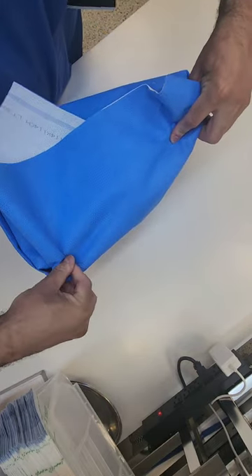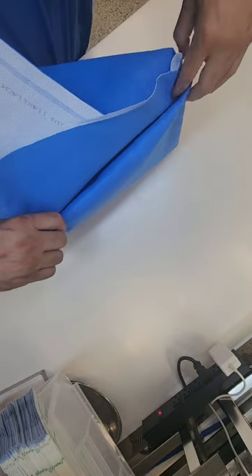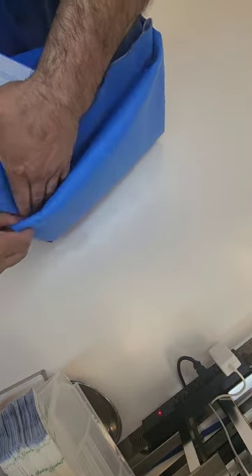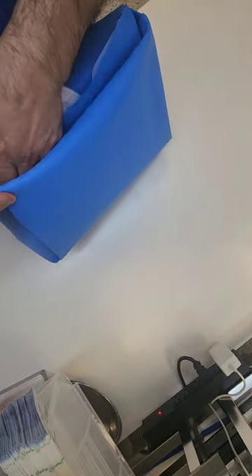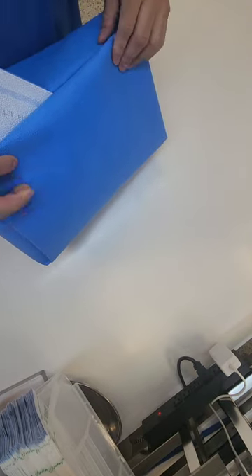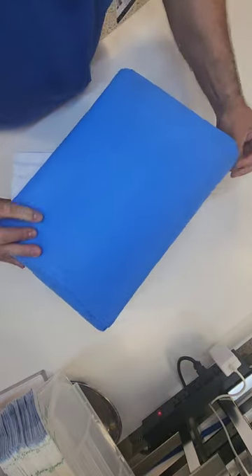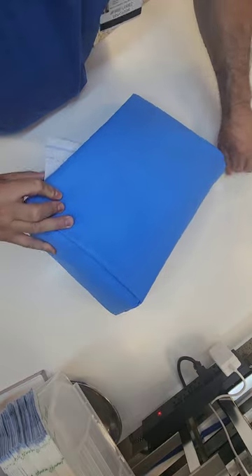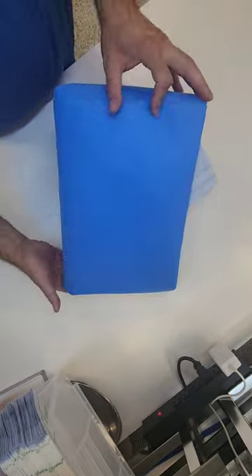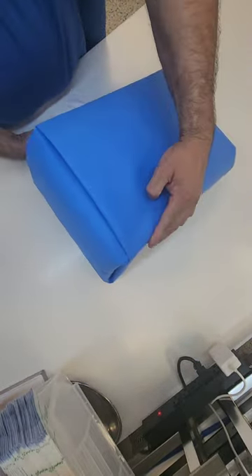And then you're just going to go ahead and tuck all that in under the original two folds. Keep on tucking until it goes all the way under and you create a nice little lip there. And there you go, guys — that's how you fold a triangle on the side slant. It took me a minute to practice this fold, but it's still a pretty wrap.